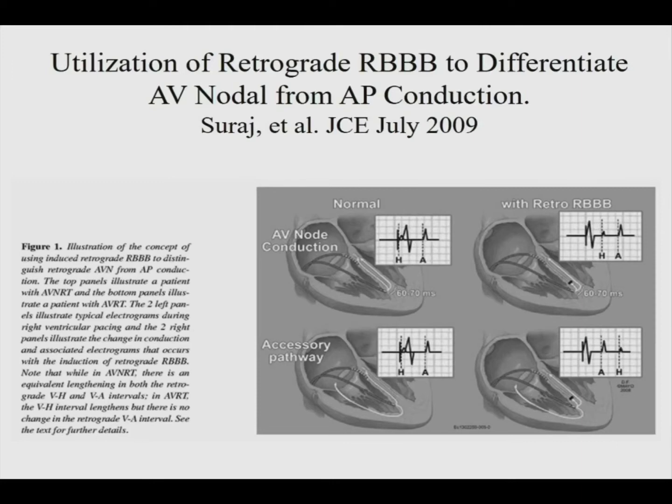It's another way of saying that the His and the A are linked or not. Because if you think about that, that's really the same concept, are the His and the A linked. The problem with wobble is sometimes you get compensatory changes in the other part of the circuit and you'll see changes in both measurements. But it is a useful thing to look for. What else?